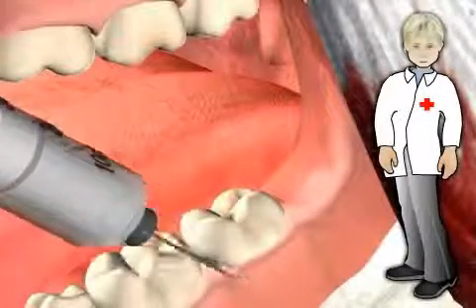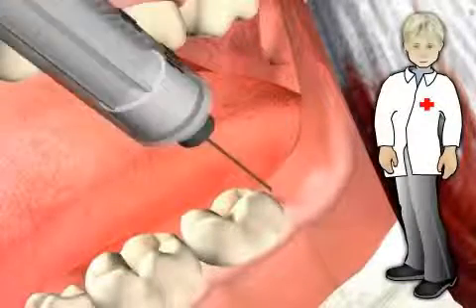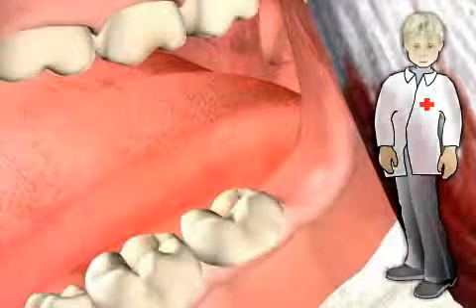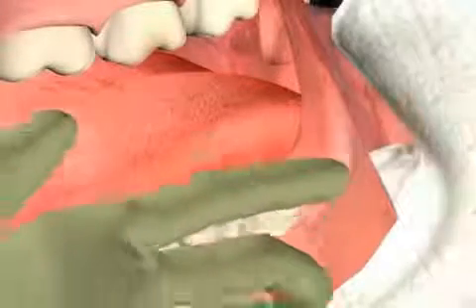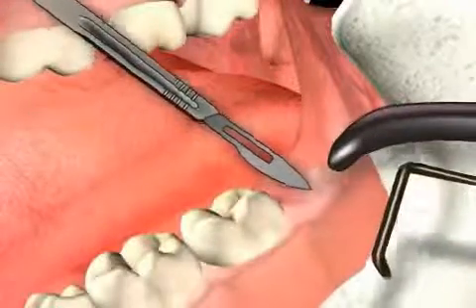As a rule, surgery is performed under local anesthesia and is a routine operation. In the following video, a minor opening is performed because the wisdom tooth is in an easily accessible position. If you'd prefer not to see any blood, return to the beginning and click on Animation.